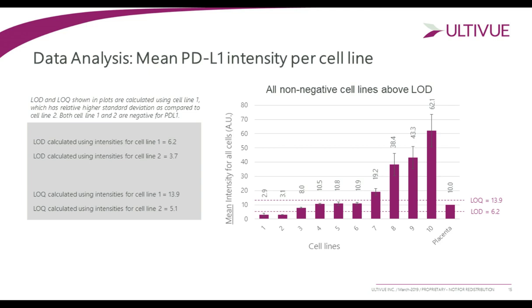Going back to what I was discussing earlier, when people initially started looking at PD-L1, PD-L1 positive or negative was really what you were looking at. The more we understand PD-L1 and its interactions within the tumor microenvironment, the more we find that the amount of PD-L1 and the type of cell PD-L1 is on is becoming more and more important.